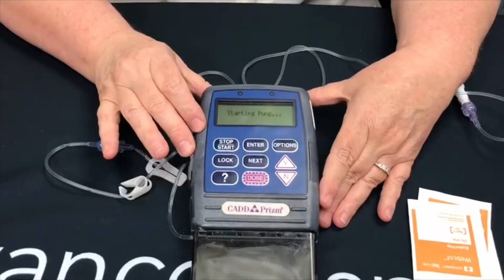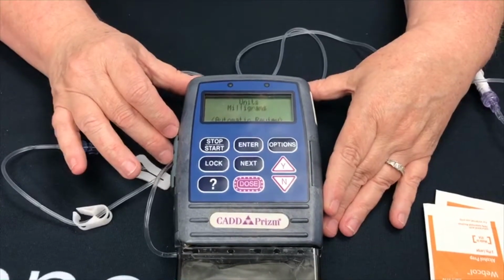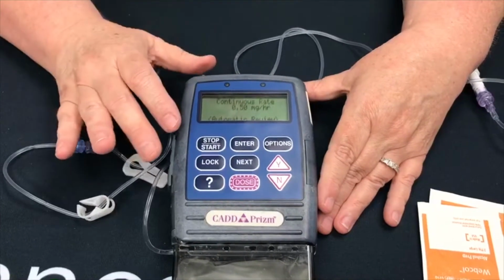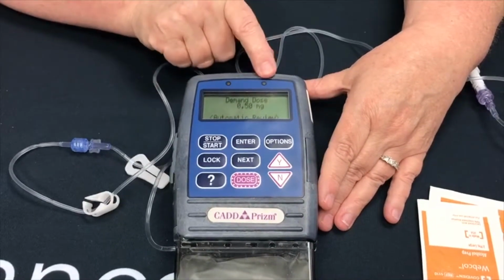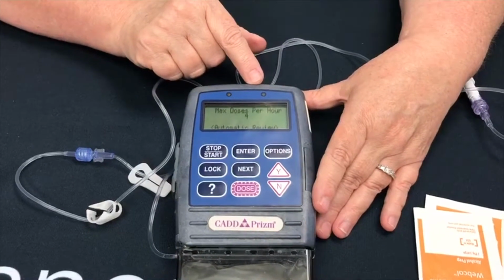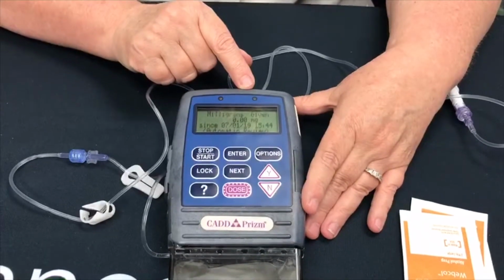And my pump begins the startup process. It again is going to walk through all the settings that have been put into the pump by my pharmacist. Once it has reviewed all of the settings, we're going to see this amber light become a green light. And we will notice that it is in what we call the running mode. So we would know our pump is working. Give it just a minute.